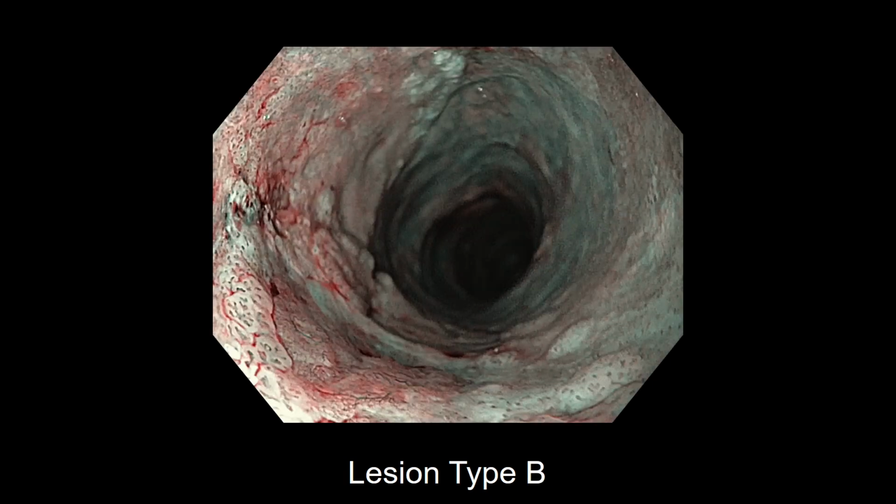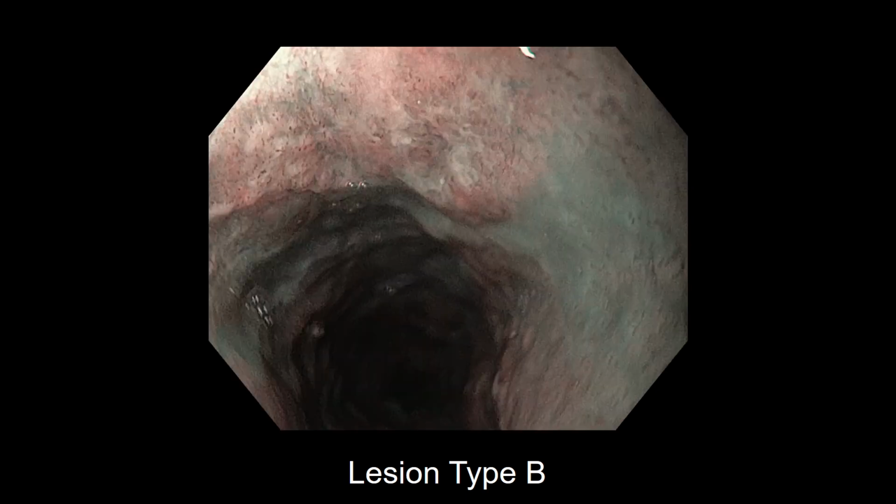Somewhere in between, we notice here that there are more depressed areas, like here. Also in the next area, it looks like we have not really a lot of vessels, and it looks a little bit depressed. Yes, in this kind of very widespread lesion, a depressed area has more risk of deep invasion than an elevated area. So this part is more suspicious for submucosal invasion. We need a more close-up view to evaluate whether there is any big vessel or not.